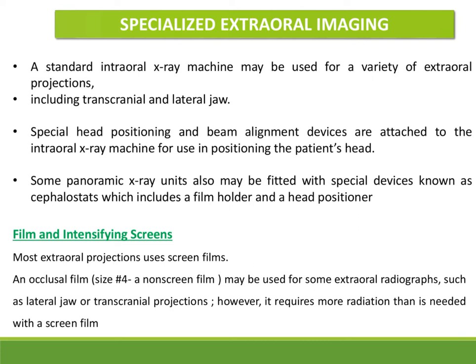The last part is your specialized extraoral imaging. A standard intraoral X-ray machine may be used for a variety of extraoral projections including transcranial and lateral jaw. So transcranial means you're going to take the side of the face and the TMJ. So for the TMJ, we have different methods when we use a film-based extraoral imaging procedure.